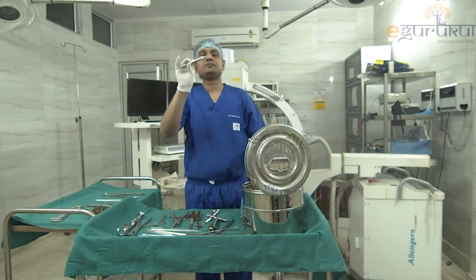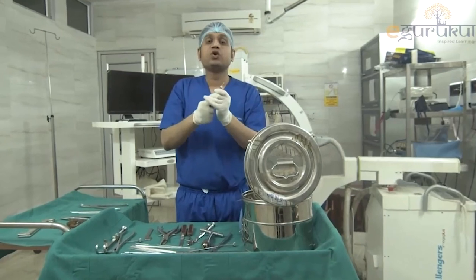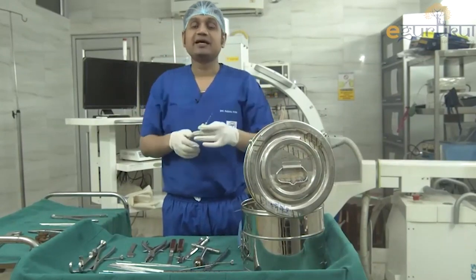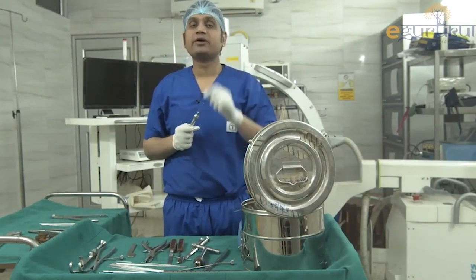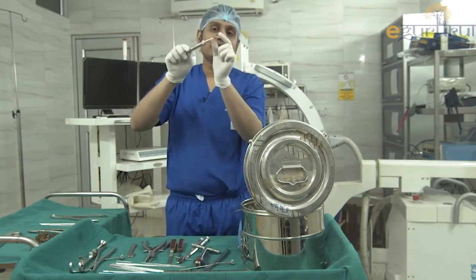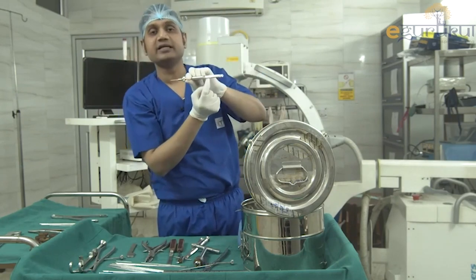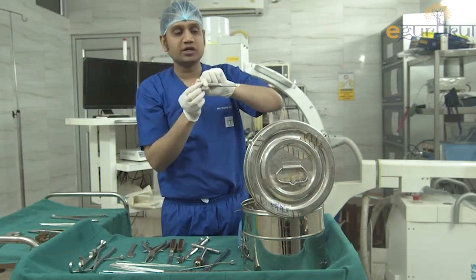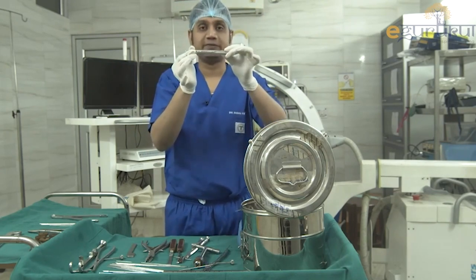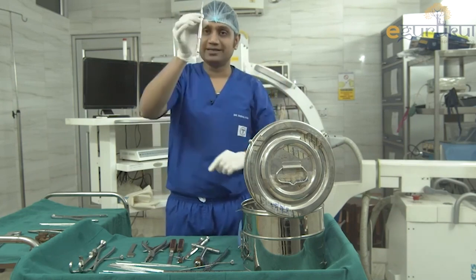Next is the depth gauge. After making a hole inside the bone and placing a plate, you need to know what length of screw to use. The depth gauge is inserted into the hole, and the markings on the instrument show the length — for example, if it reads 28, you use a 28 mm screw.